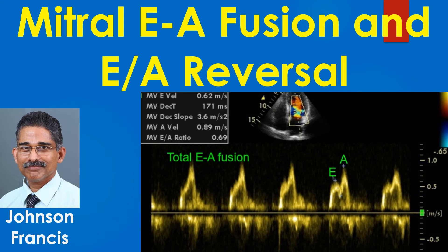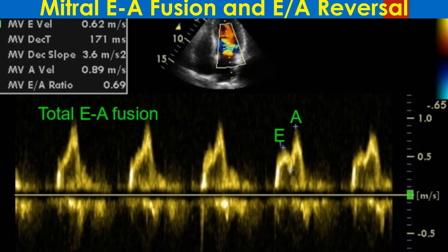Discussion on mitral E/A fusion and E-by-A reversal on Doppler echocardiography, and the assessment of left ventricular diastolic function in the presence of mitral E/A fusion. A transmitral Doppler tracing from the apical 4-chamber view shows varying degrees of fusion of mitral E and A waves. E-by-A reversal is also evident in the later 3 beats due to partial E/A fusion.